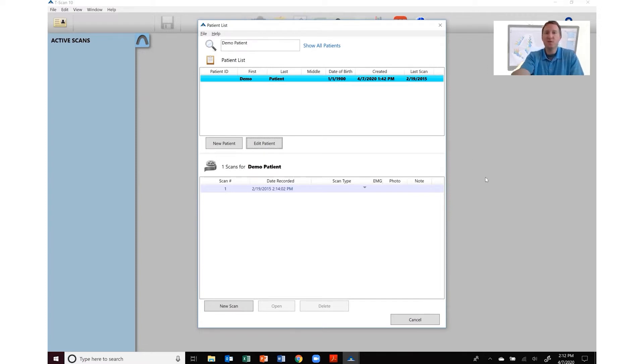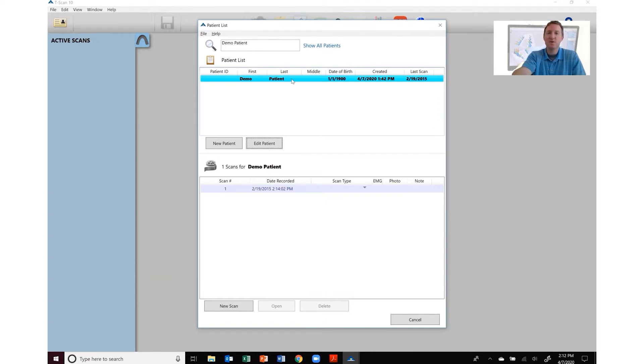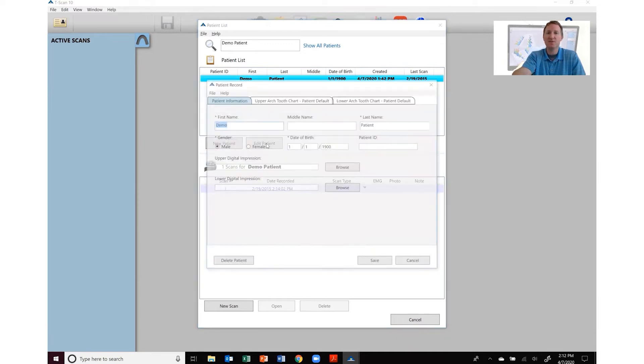The second thing you want to do is locate the patient that you want to import those files for. In this case we're going to use a demo patient and then we're going to click edit patient.